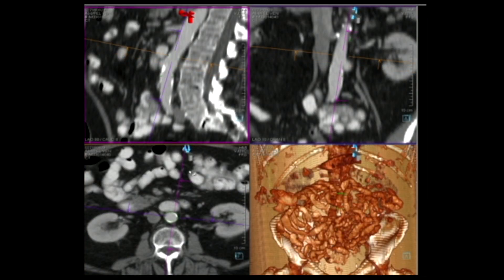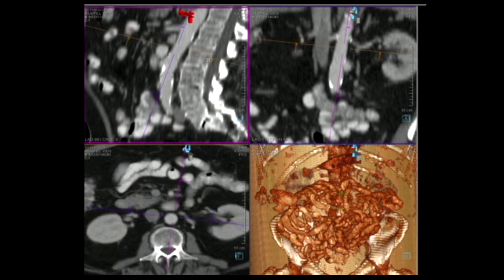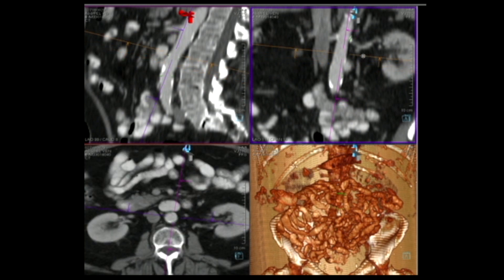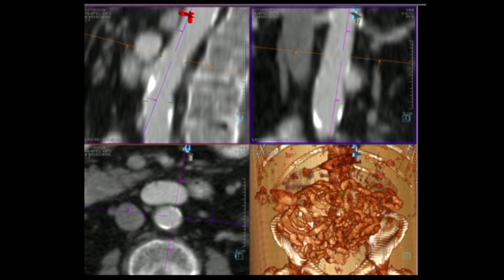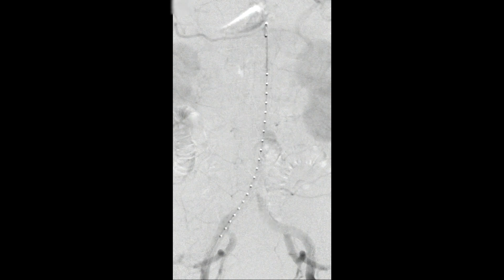What you can see is this work in the CT scan, which is actually being used in the control room. We strongly believe that a good quality CT scan preoperatively will allow us to actually plan the entire operation. You'll see us start putting the fusion together and mark the landing zones which we'll use based upon those fusion marks. All of this is done before we go to the operating room.